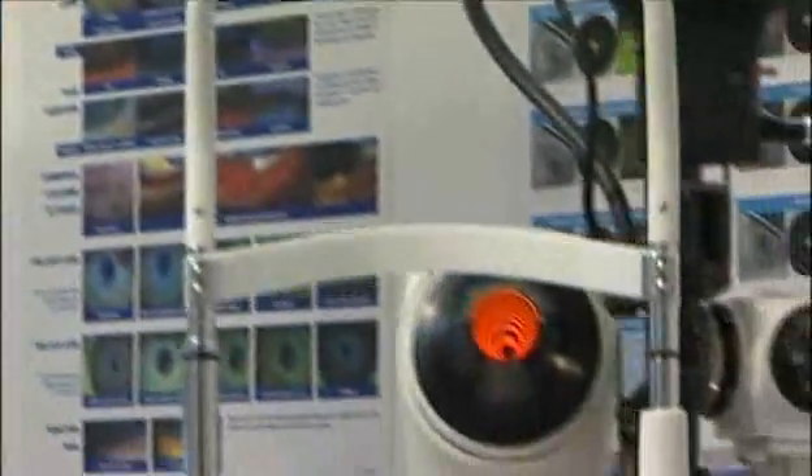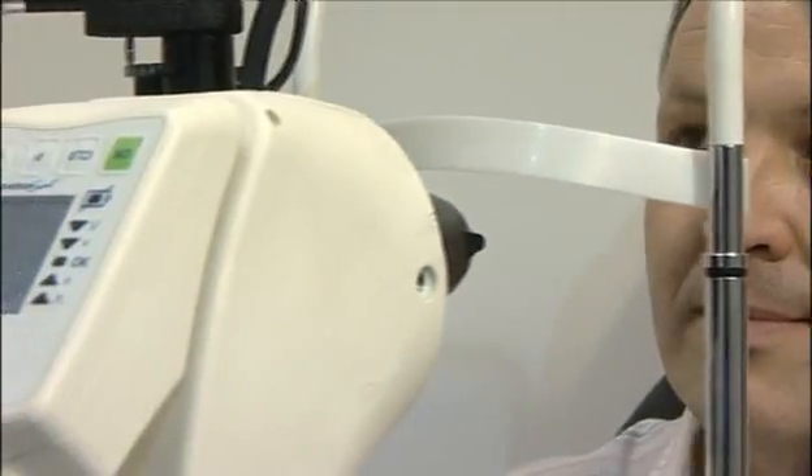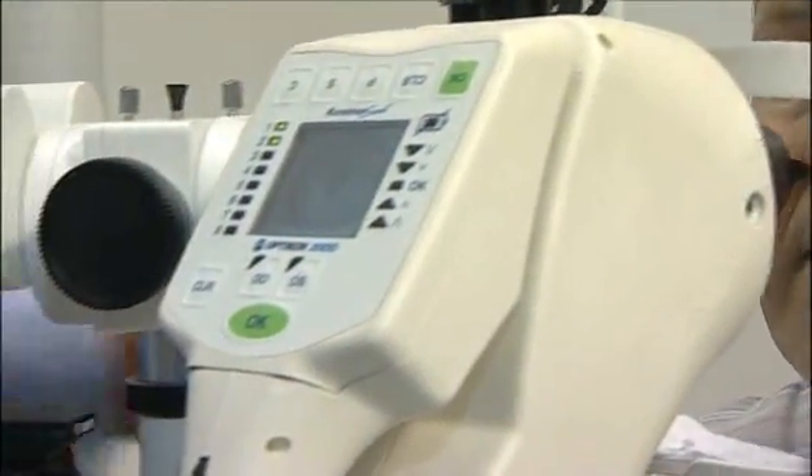If you want less hassle, it's no more expensive than any other topographers. It's never ever let us down, which is another plus, so I'd have no qualms about recommending it. The Keratron Scout is quick and easy to use, allowing you to capture images and email the data directly to Lab 7 within only 5 minutes of seeing a patient.